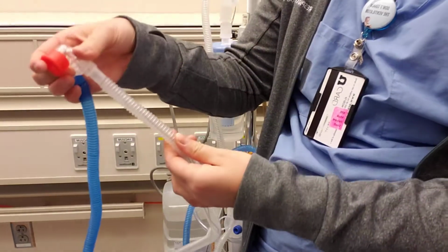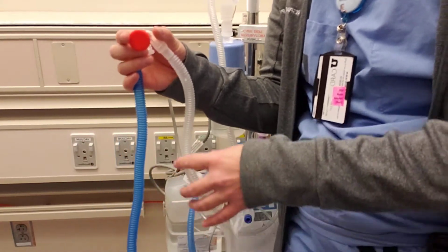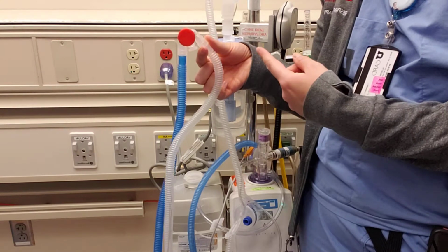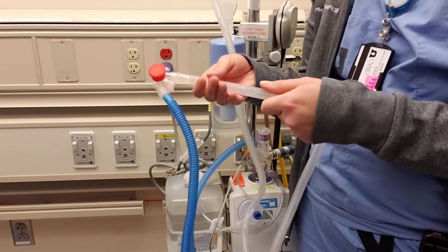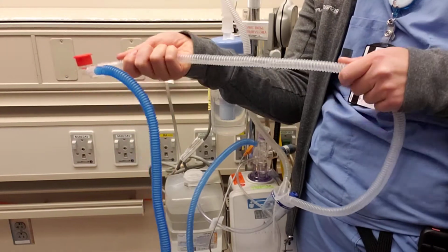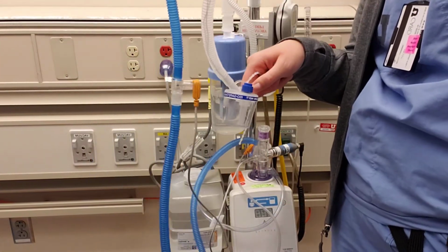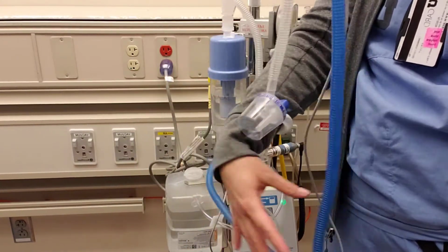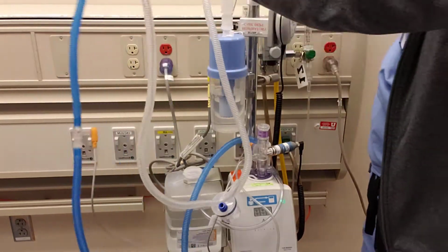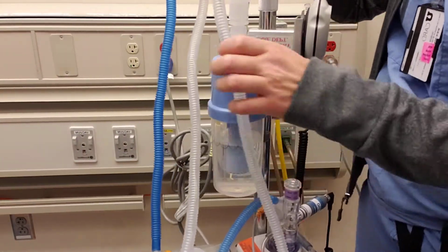Following that out, we go to the expiratory limb. And remember, when we're giving CPAP, it is the expiratory pressure. So we have the flow that we deliver to the baby, but it's the expiratory pressure that gives us that PEEP. Down to our little cups where we can collect rainout. We have that on both the inspiratory and expiratory limbs. Up to our bubble device.